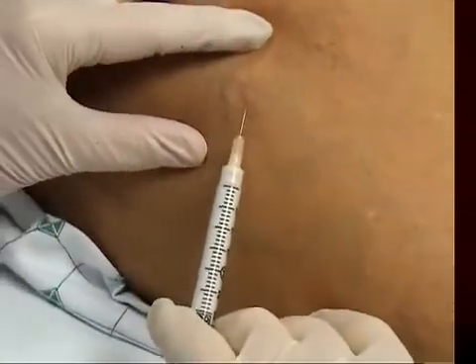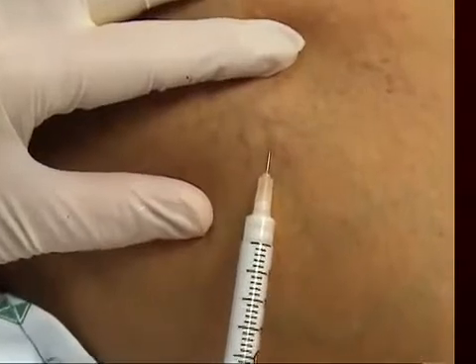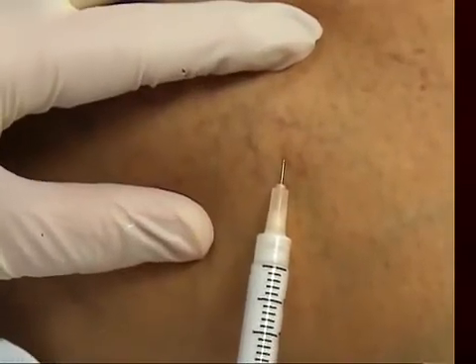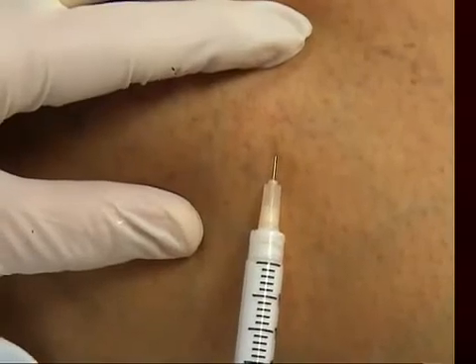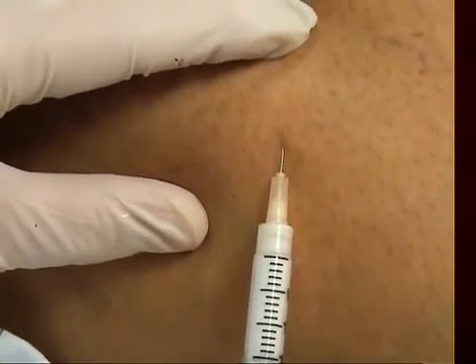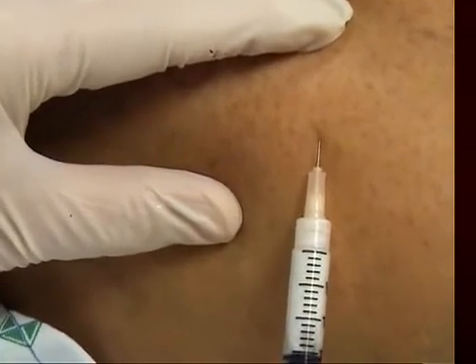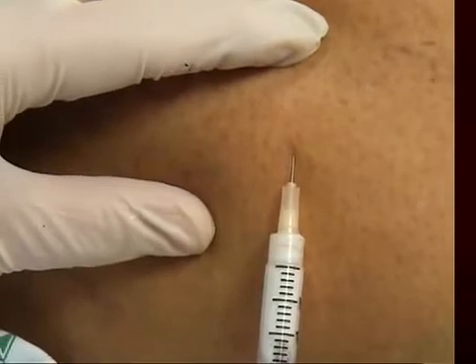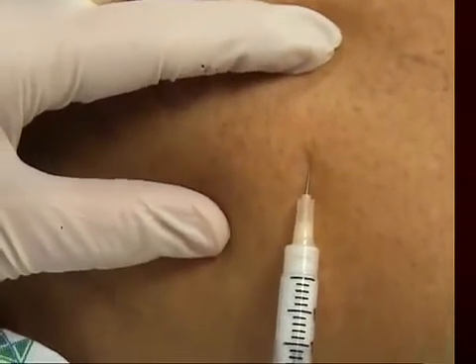I'm going to be doing a little needle here — keep very still. Into that, and there it is. Foam technique again for these vessels that are about two millimeters in diameter. I think you can see immediately they've disappeared very nicely. One question is how much do you have to put in — how long do they need to be foamed? I think 15 to 20 seconds is probably enough.